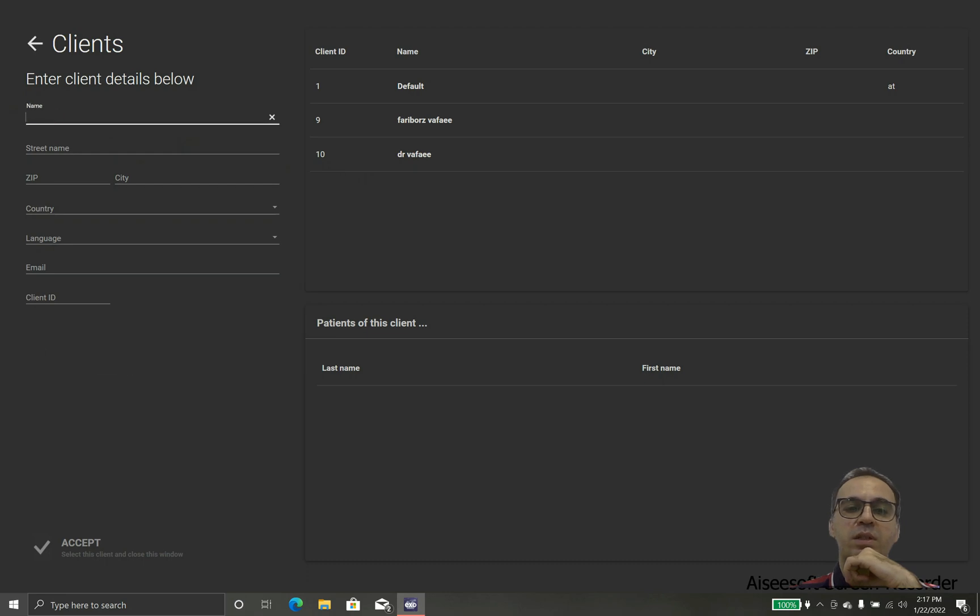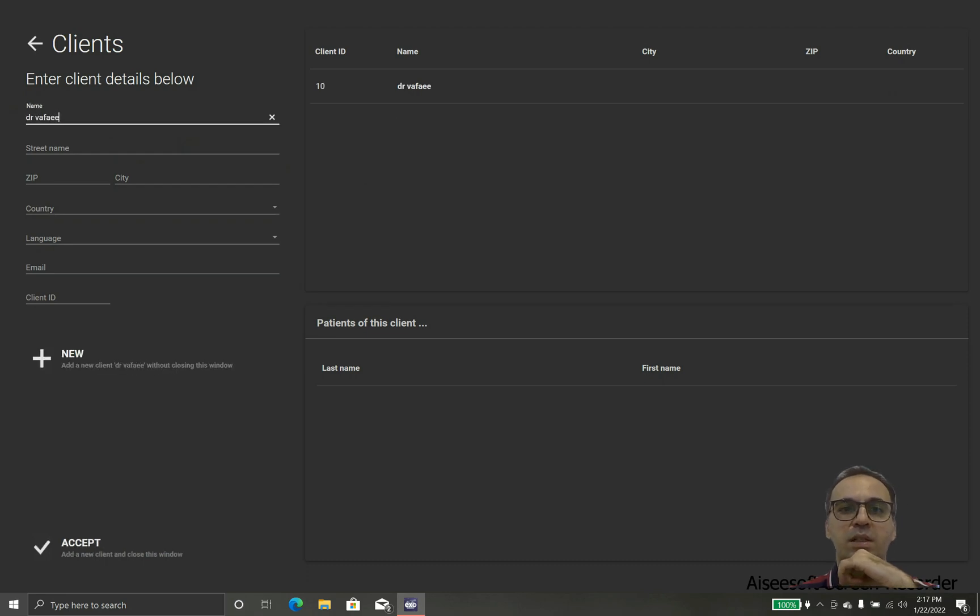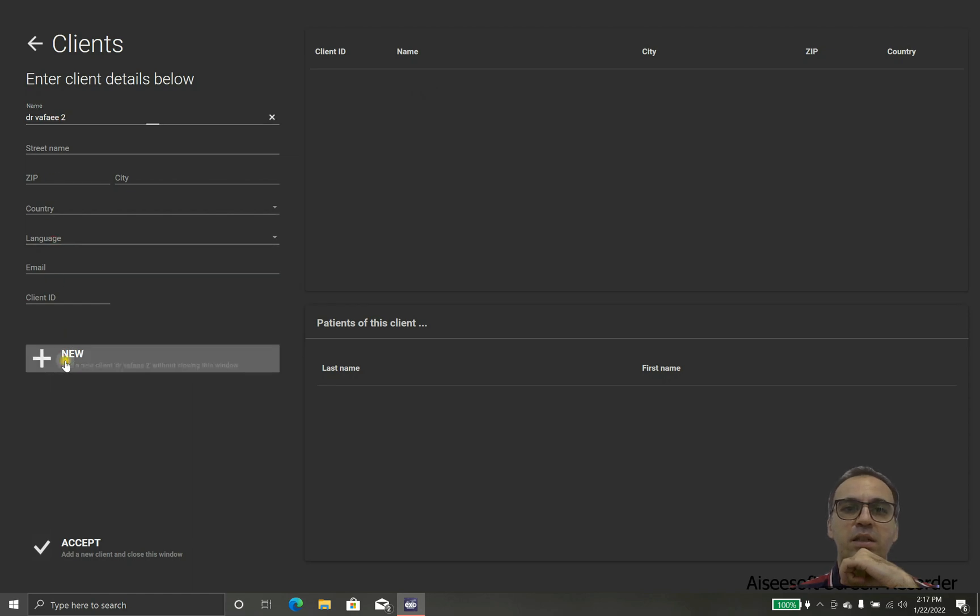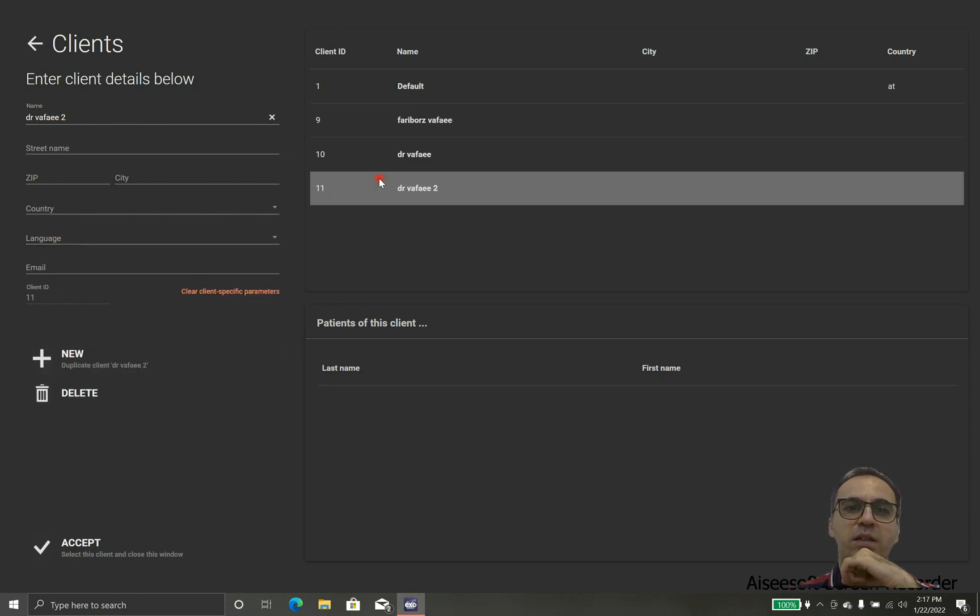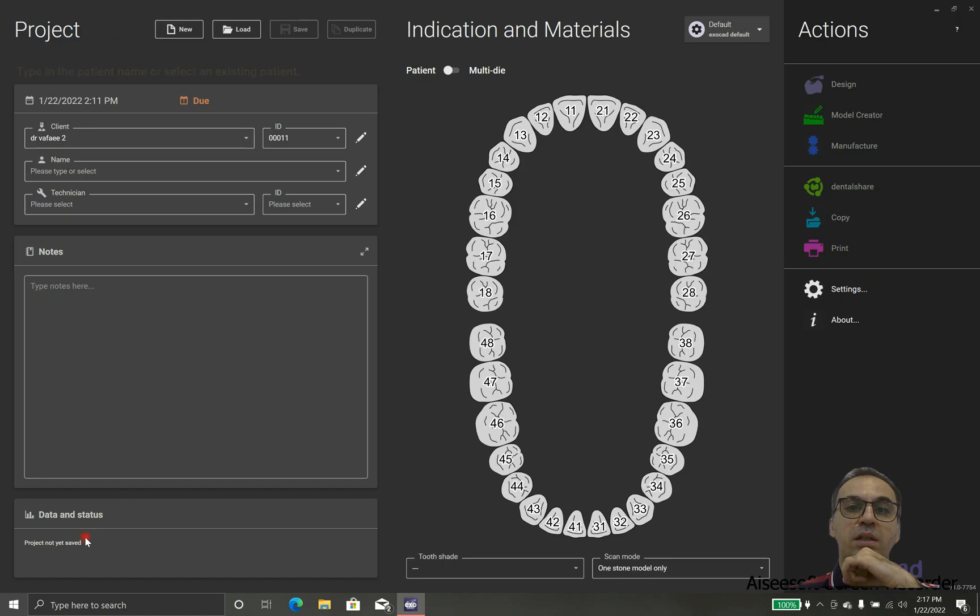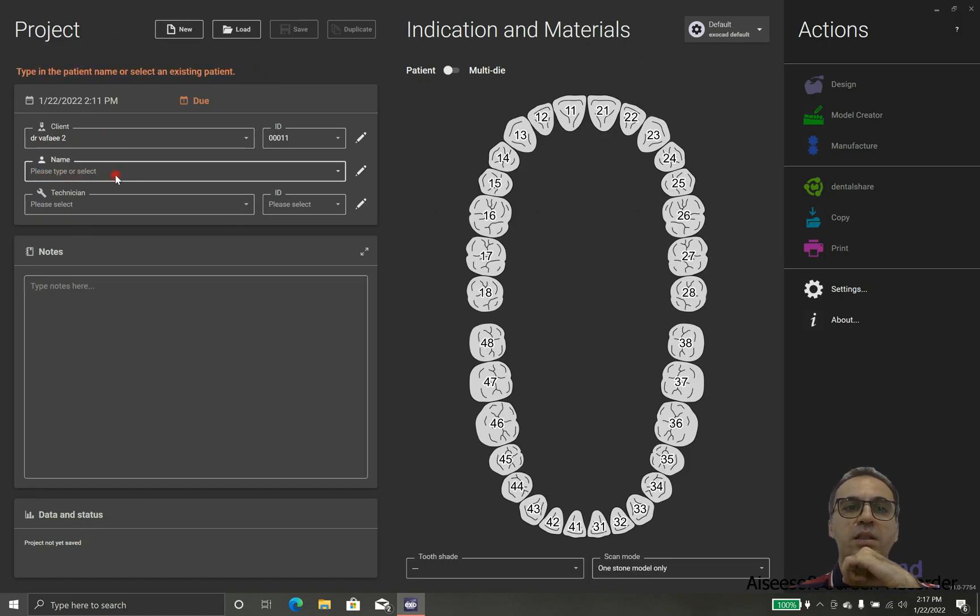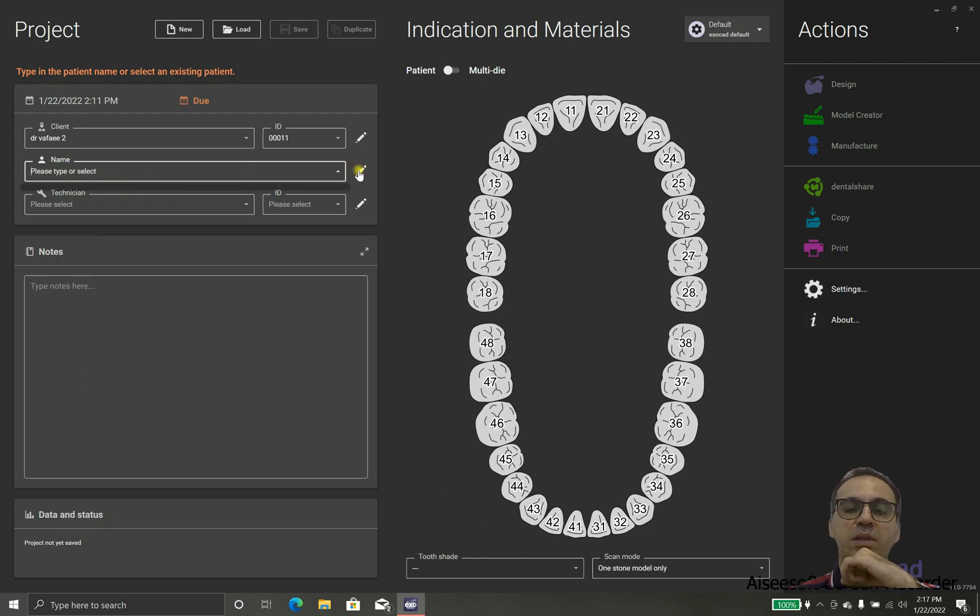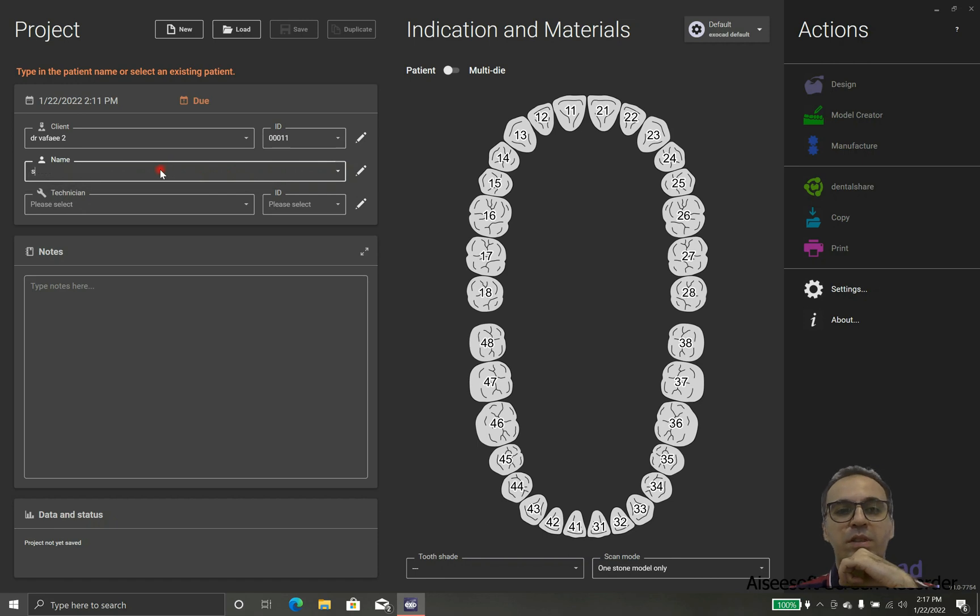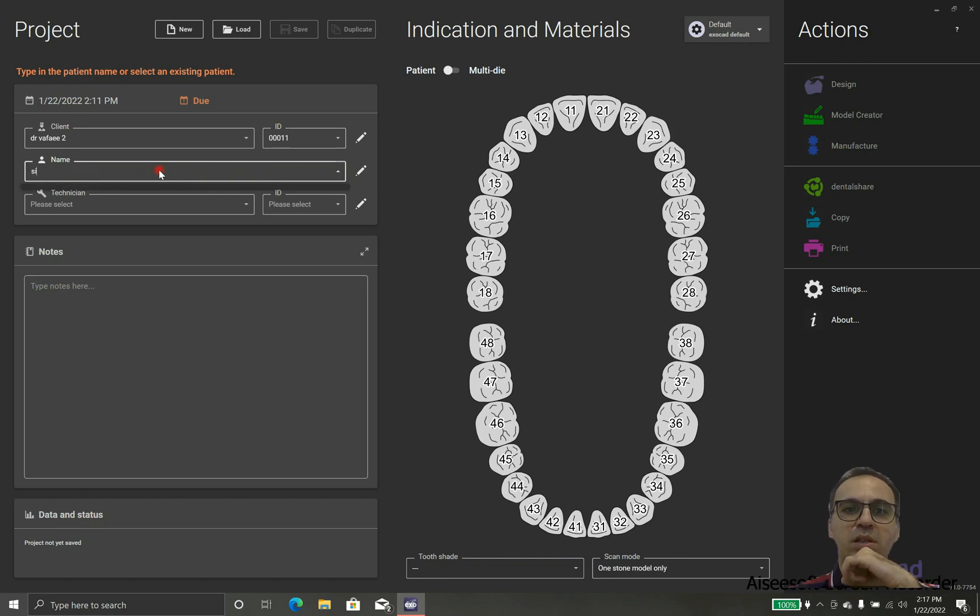The first thing in the left is client, and in case that we have that client in our database we can use it. Otherwise, we can add a new client simply as that: plus new and accept. Now we have new client.